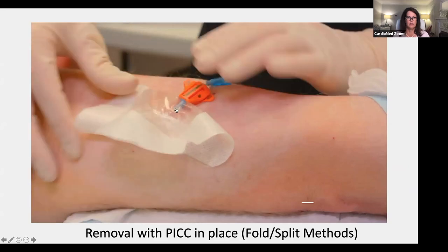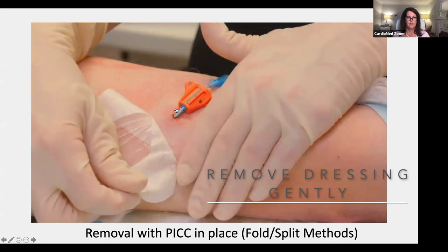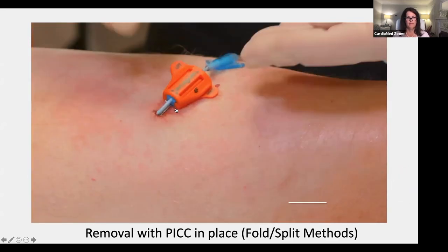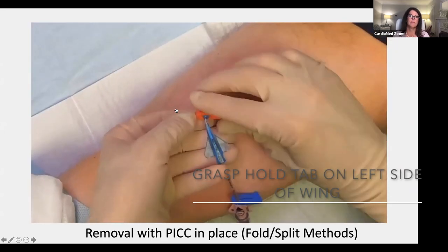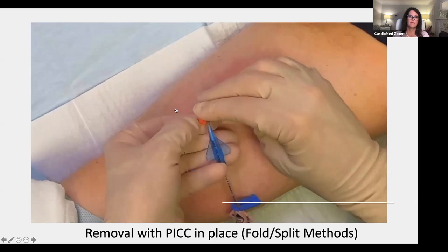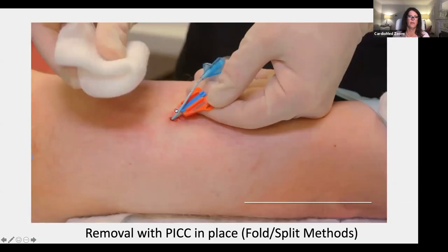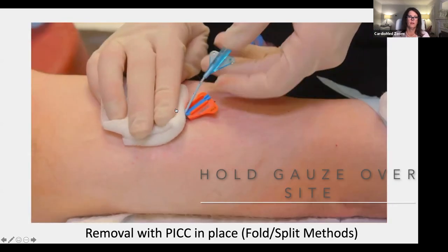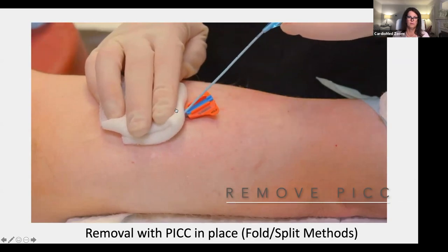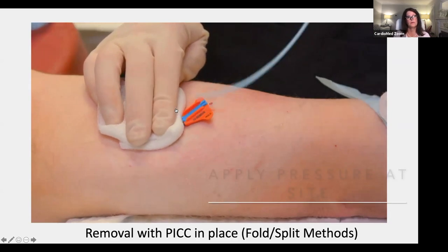Remove dressing. So remove the dressing gently. Grip the hold tab on the SecurAcath with the thumb and finger of one hand to stabilize the device and the securement feet beneath the skin. Pry upward at the edge of the lift tab with the index fingertip of the other hand to release the cover from the base. Place sterile gauze over the insertion site. Remove the catheter. Do not use excessive force. Hold pressure at the insertion site until hemostasis is achieved.